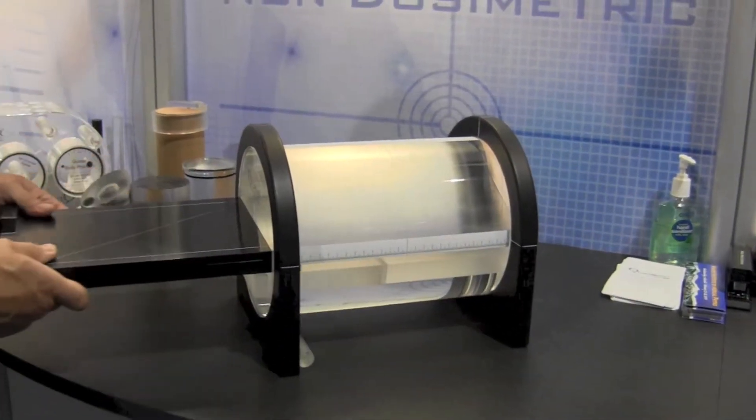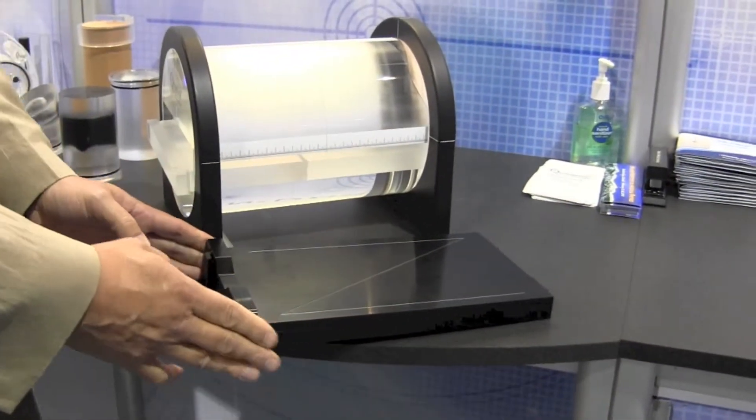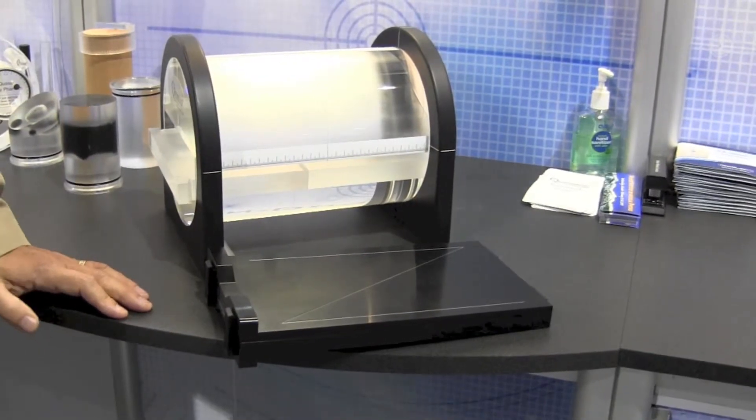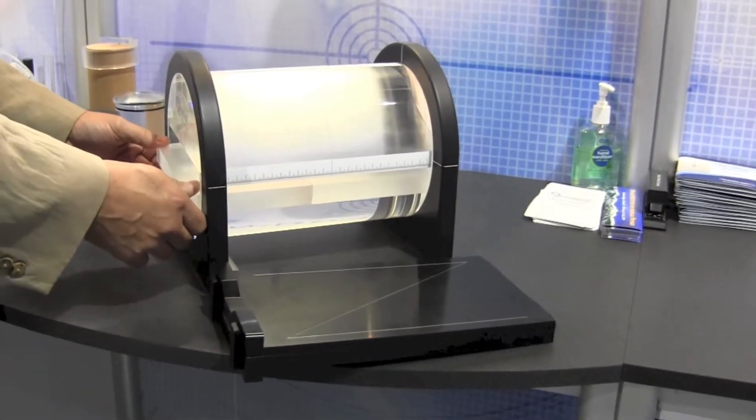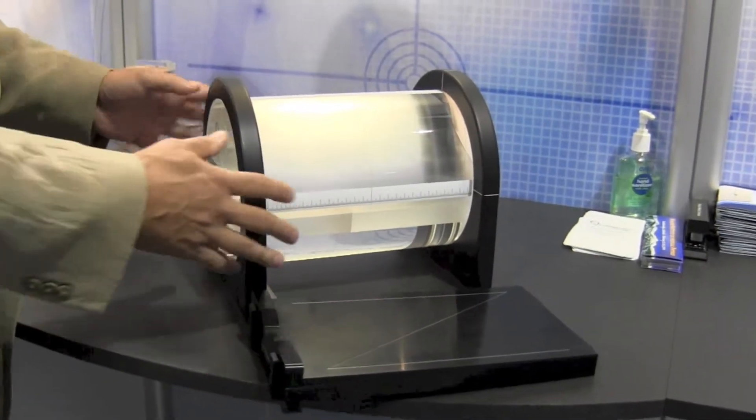Within the Phantom I have inserts for film. This is an opaque cassette for light sensitive film, for wet process film. We also have a cassette for gaffchromic film, for radiochromic film.